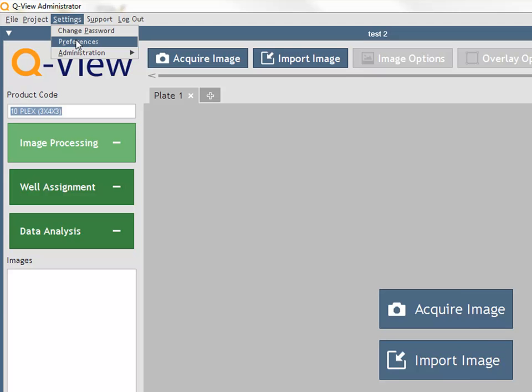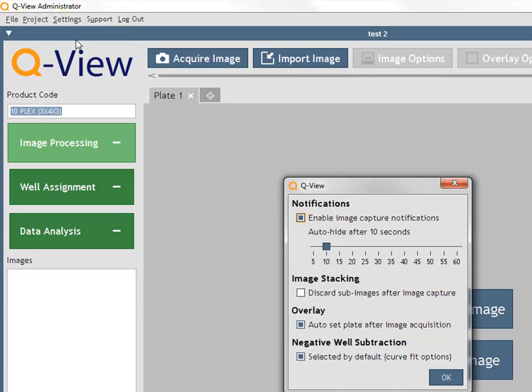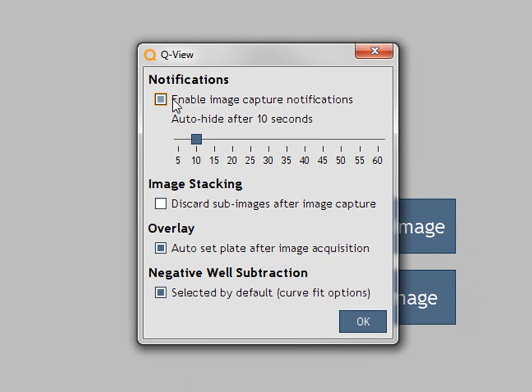Set preferences for notifications, image stacking, auto set plate overlay, and the default setting for negative well subtraction.